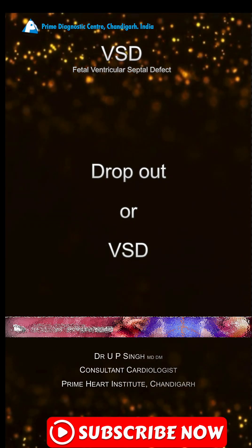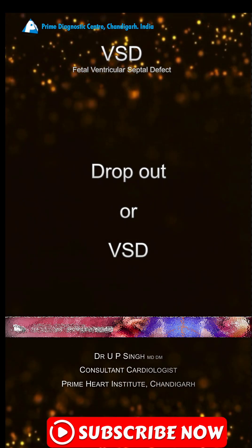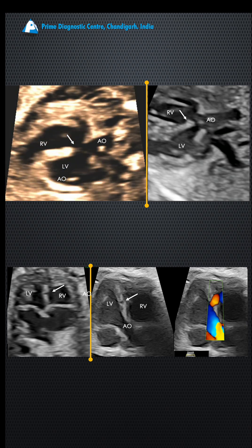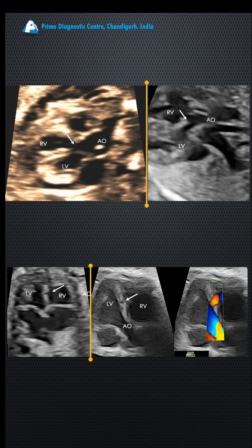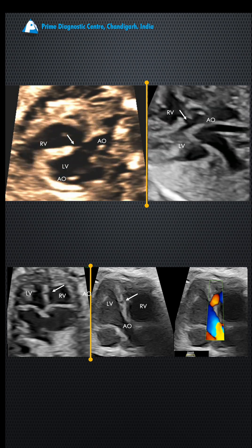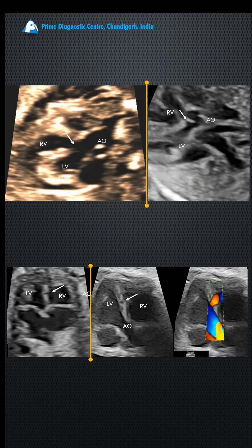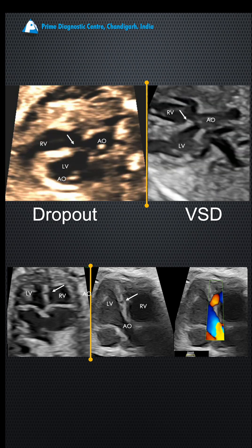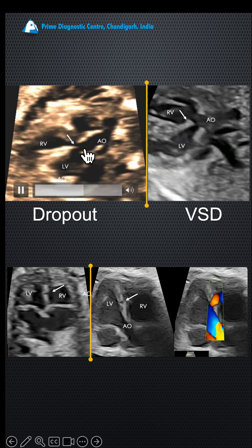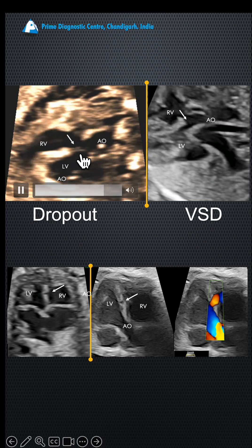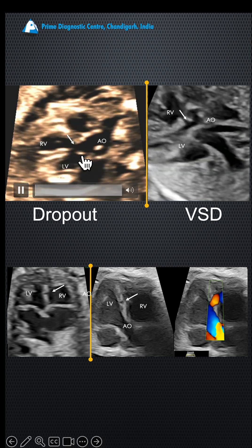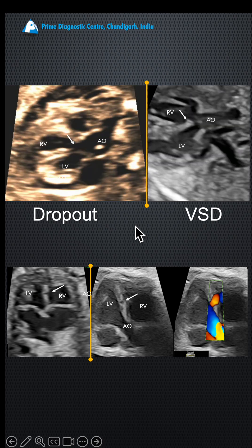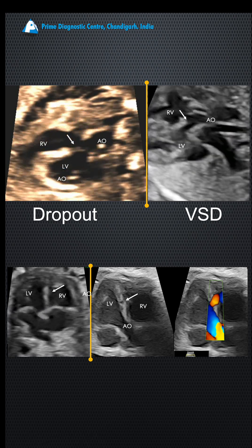A common clinical situation: how do you differentiate a dropout and a VSD? Looking at this panel, you see two gaps — which one is a VSD and which is a dropout? The first one is a dropout, the second one is a VSD. The reason is that a VSD cannot happen above or superior to the aortic valve — it has to be in the ventricle. So this is a dropout in the sinus of Valsalva.